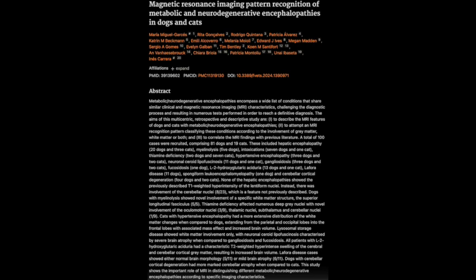Fascinating. So another interesting finding was in the dogs with myelinolysis. They all had the expected involvement of the thalamus, but they also had consistent involvement of the superior longitudinal fasciculus. Okay, now hold on. Break that down for me a little bit.